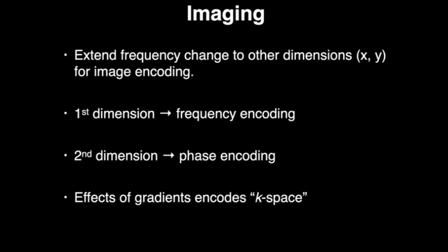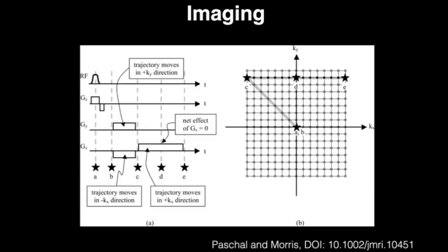However, it turns out there's another very interesting way that you can think about this and how it interacts with your imaging hardware and your imaging gradients. So remember, we talked about our protons, our resonance for the most part. This diagram on the left here is a pulse sequence, and this shows what the scanner is doing to try to image or get a signal from that proton sample.